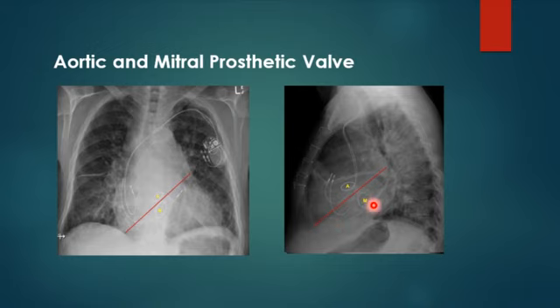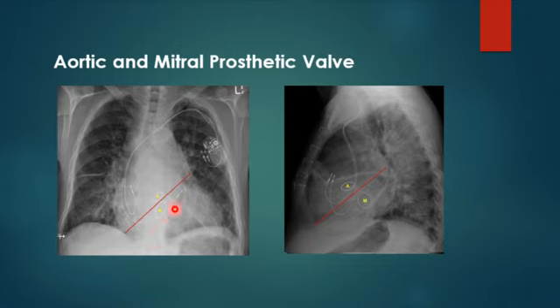This patient also has a pacemaker with two leads — one at the right atrium and one at the right ventricle. Due to cardiomegaly, the heart is slightly shifted.